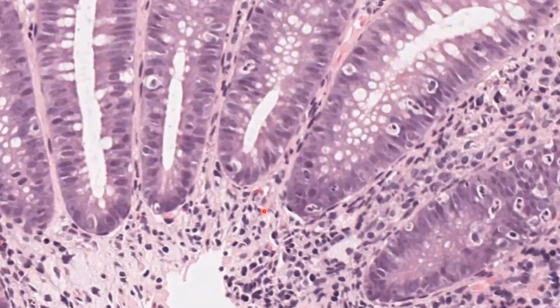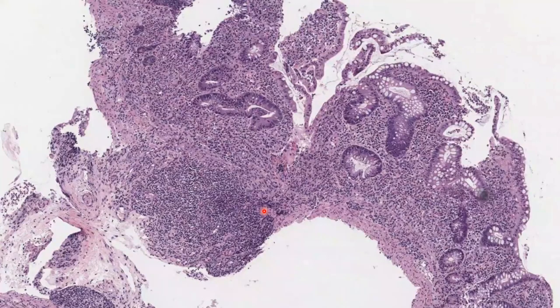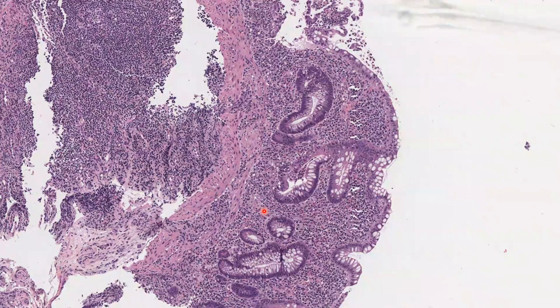You can either get or not get a basal plasmacytosis, that's absolutely fine. Here is a profound example with a lot of crypt architectural distortion. If this was only a rectal biopsy from the distal rectum, your pouch above shows mild or no inflammation, and your other ileal proximal pre-pouch biopsies are normal, then in that scenario, if this was isolated to this site and you have a strong history to suggest indeterminate colitis or UC before, you can say that the biopsy you have sent is involved with the original disease of UC, and therefore something will have to be done, okay? But apart from that, you can't.